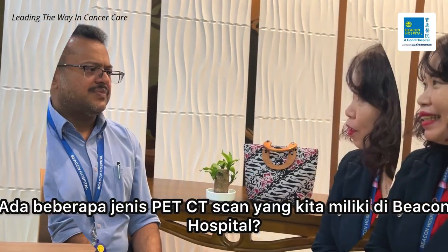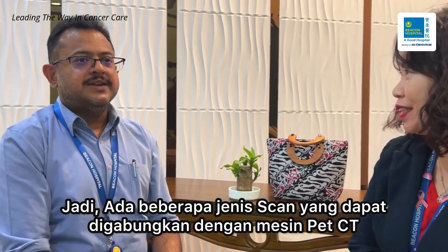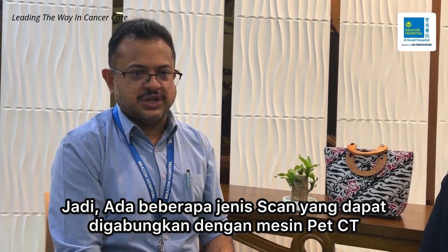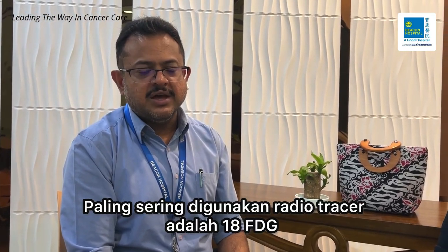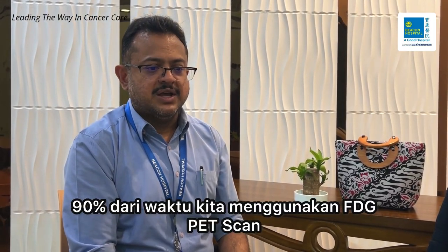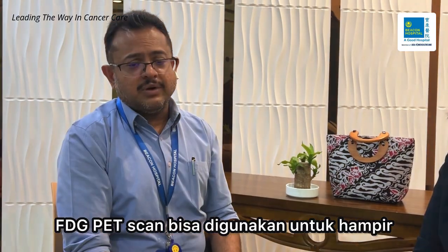How many types of PET CT scan do we have in Beacon Hospital? So there are many types of scans that we can do with the PET CT machine. The most commonly used radiotracer is 18F-FDG. In oncology cases, 90% of the time we use FDG PET scan.